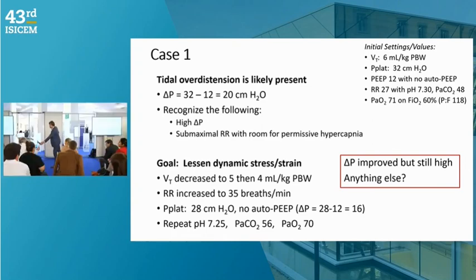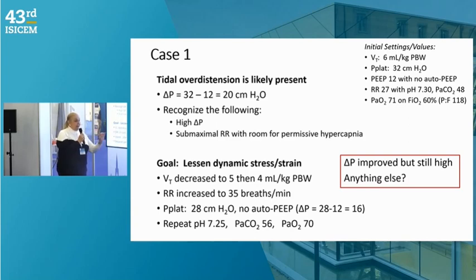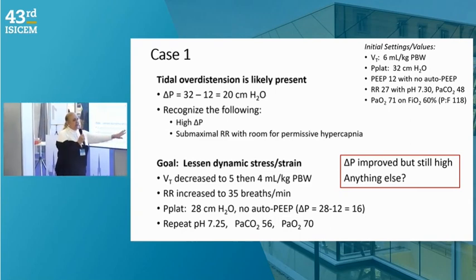And you had some. Yeah, just one explanation for you. If you prefer to change some variables, tidal volume is better than respiratory rate. There is a paper published by Luciano Gattinoni and his group showing which is the variable that induces more damage. So, for instance, in this case, his therapy is perfect because he has to choose something, and he decides to reduce the tidal volume.